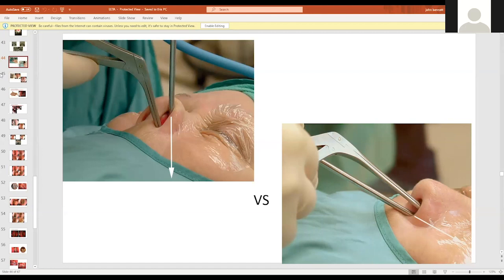So my tip for people to practice this approach is, when you get through the nose, go down first. Because when you go down, you see the nasal floor, you see the inferior turbinate, you will always see the sphenoethmoidal recess. And it's really difficult to go down and get to the brainstem, because you would have to drill all the bone. But it's really easy to misplace your endoscope and go straight to the ethmoid bone, to the anterior fossa. This is one of the common mistakes. So you go down first, it's easy, it's safe, you see the sphenoethmoidal recess, and then you can go upward.